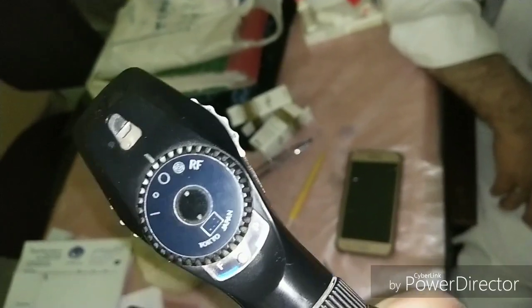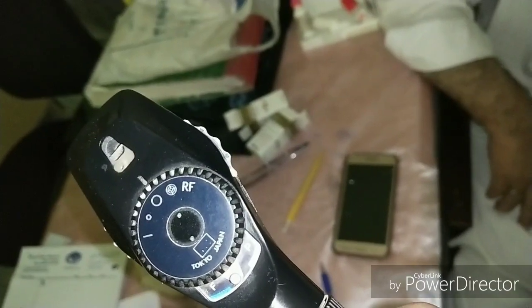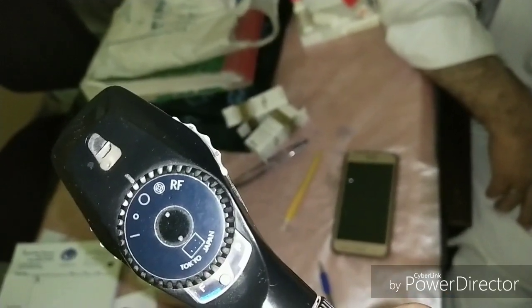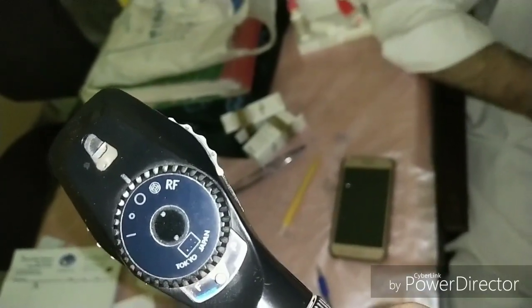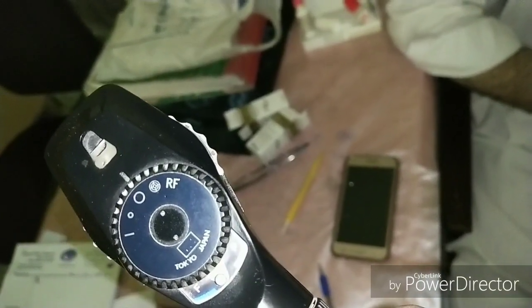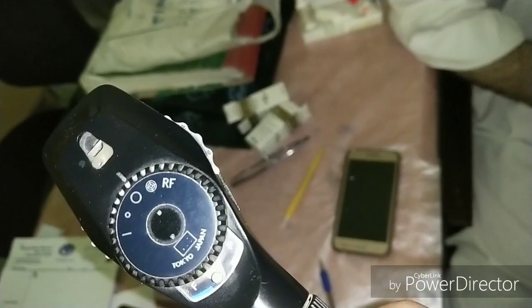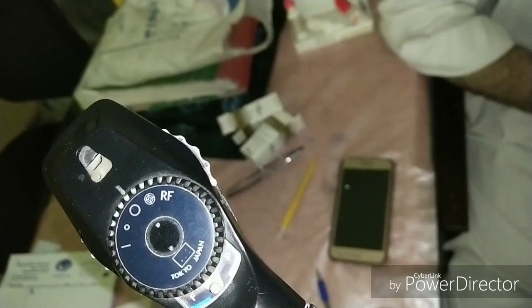The small pupil filter is for the non-dilated patient, and the large pupil filter is for the dilated pupil. The visuoscope has a central point that is focused on the fovea — if the patient has central fixation, and if not, then eccentric fixation, while the patient should focus on the center as well. Red-free is used for vitreous opacities, retinal vessel pathologies, nerve fiber layer defects in glaucoma, and cystoid macular edema. The cobalt blue filter is for corneal pathologies stained with fluorescein, such as in dry eyes and corneal ulcers.